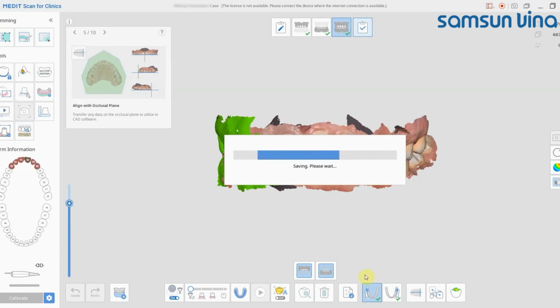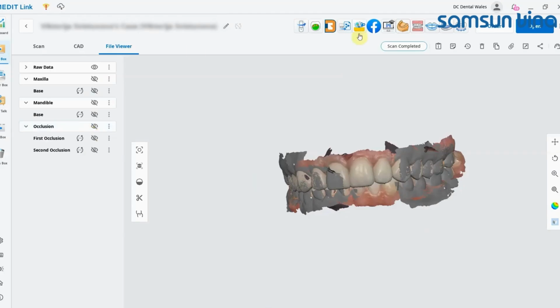This one I do see every now and again, and most people I think work the problem out by themselves, but occasionally you'll see a case that's processing and it's stuck at a certain stage in processing. It won't go past that stage, and you can leave it for hours and hours and it won't move. There's 2 things you can do. You can either close down the software and restart it, and then see once it reprocesses.